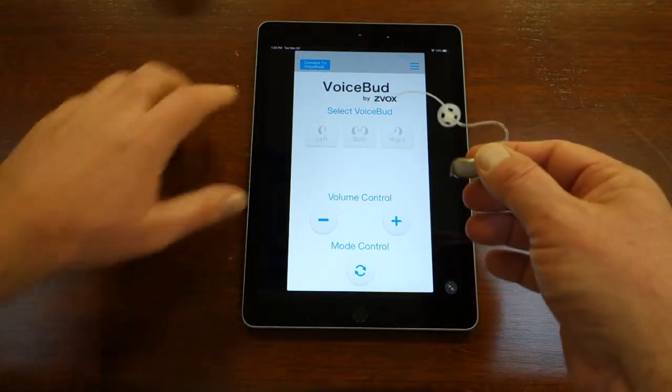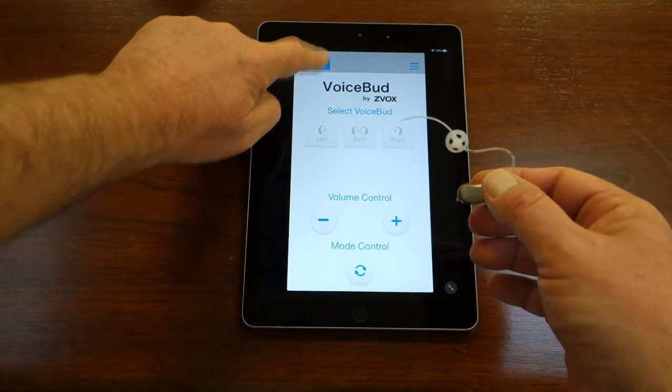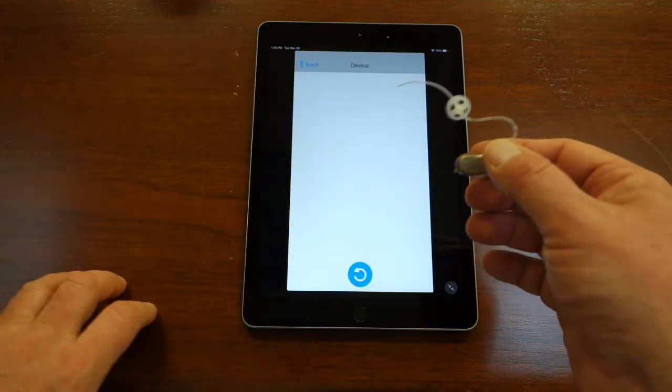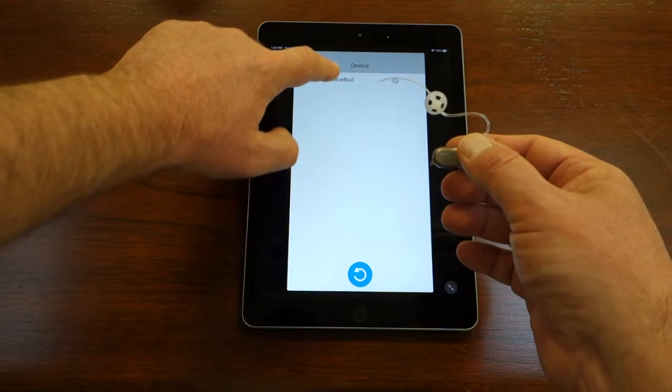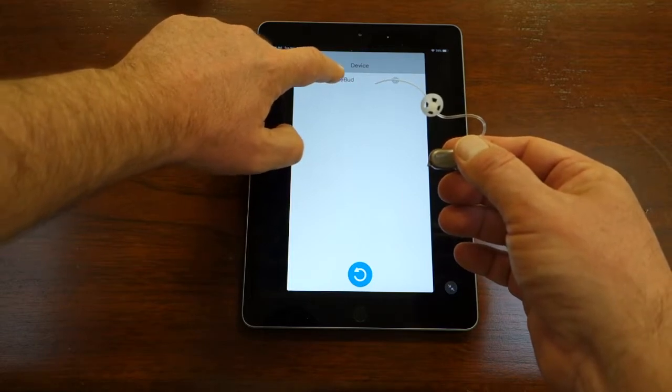Open the app and press the button in the upper left that says Connect to VoiceBuds. On the connection screen, you should see one VoiceBud appear. The screen will read Bluetooth VoiceBud.